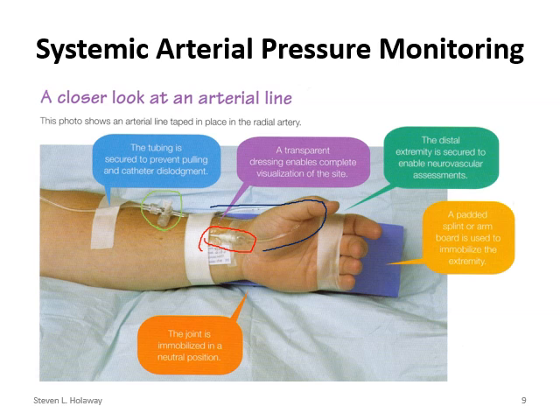You'll also notice that they have some sort of brace around the wrist. There are different types of supports that you can put on there to keep the wrist in an anatomical position. It also prevents the flexing of the wrist, which basically immobilizes that joint so that you get a good reading from it. Now it needs to be padded so that we're not getting any skin breakdown. You need to check it frequently and watch for any kind of skin breakdown.